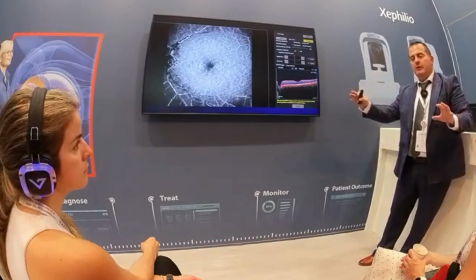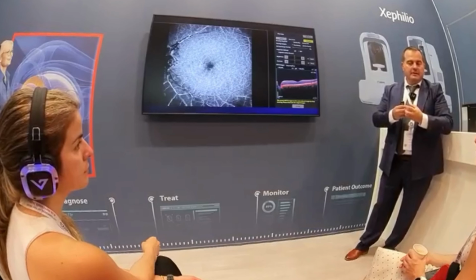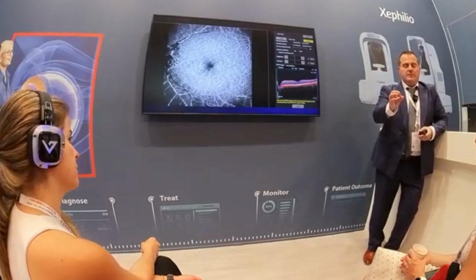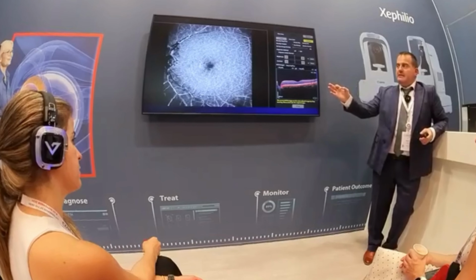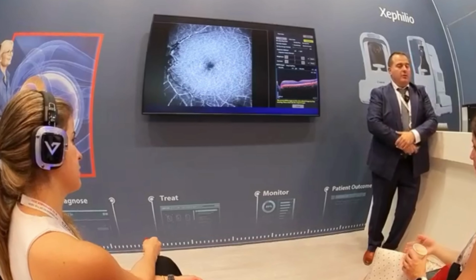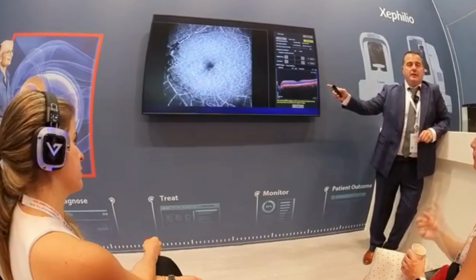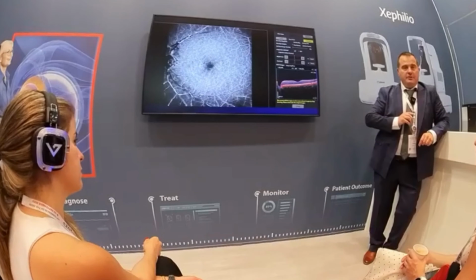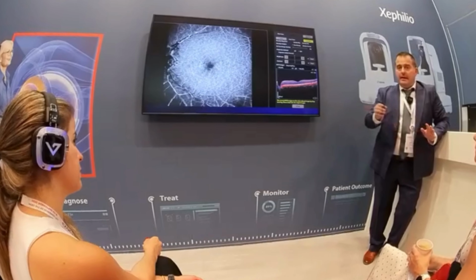I remove the silicone, and on the next day or a week later, when the air is reabsorbed, the patient says, "Oh, I don't see. I have a spot." We call it scotoma, but it is like a blind spot in the center of the eye, and we are left wondering what happens. Now I can show the patient that there is an anatomical and vascular problem which is not directly related to my surgery, and this is a vascular incident which might happen at any time.